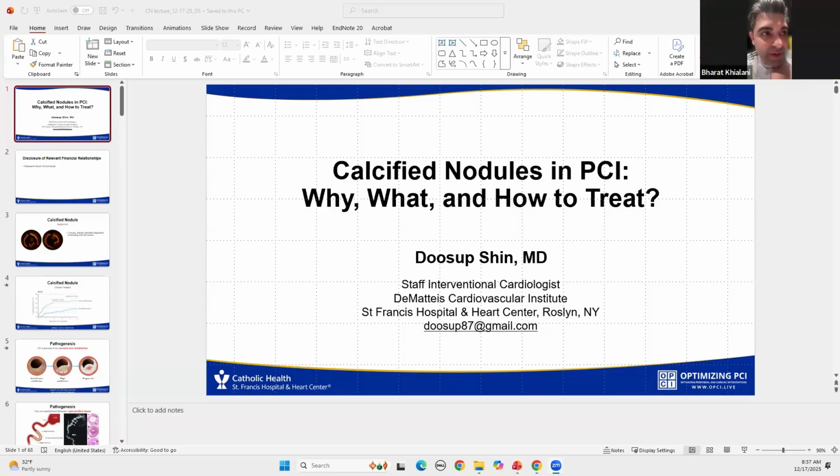Very nice talk. Bharat here from Singapore. One of the things that maybe you didn't cover, because it's probably not available outside Japan, is DCA followed by DCB, so directional atherectomy. I think our Japanese colleagues have started to do it with calcified nodules. Because you can use the balloon to direct the blade towards the nodule and shave off some of the nodule, they're having quite good outcomes if you follow it up with the DCB.